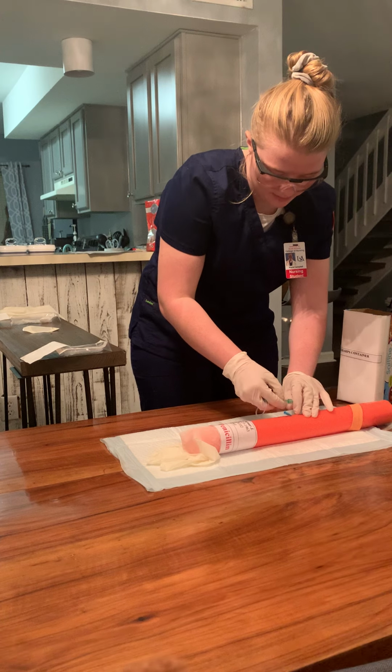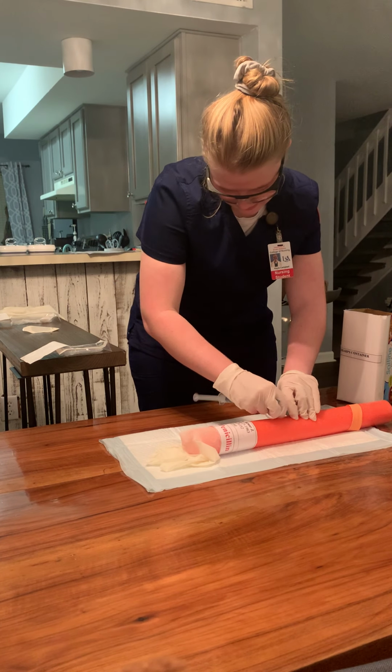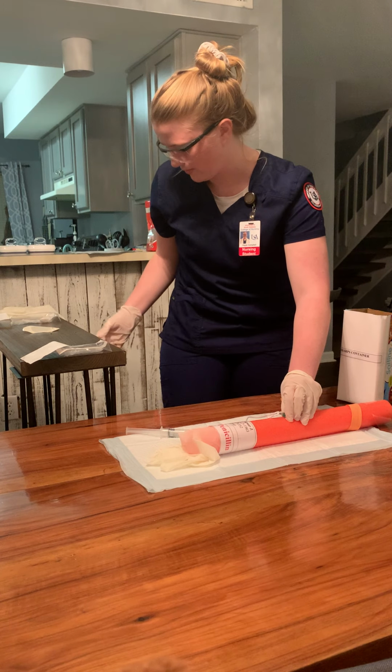Remove the cap and apply my saline lock. Secure this while I get my piece of temporary tape.